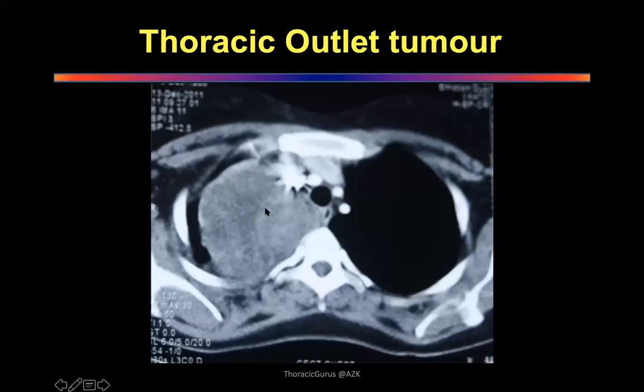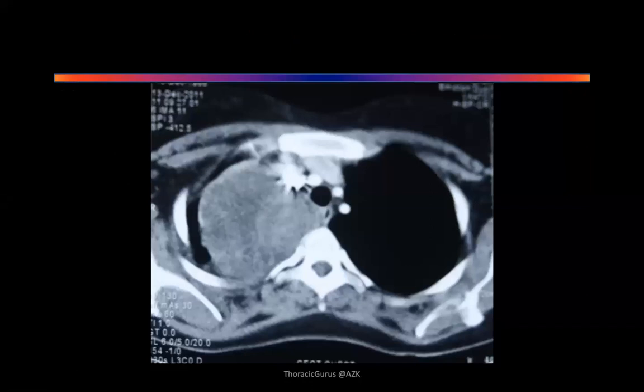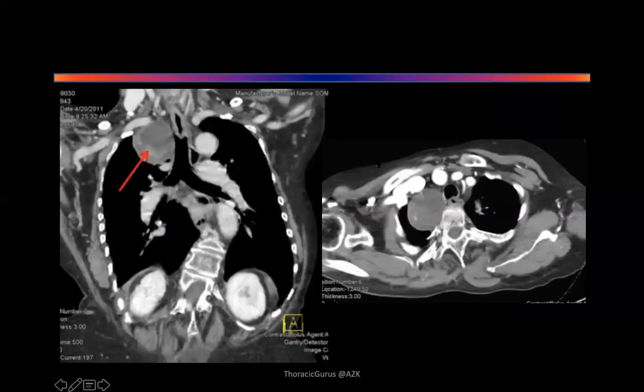Okay? Sir, in this particular thing, can we tell from which place it is coming? Posterior mediastinum? Very difficult to say that. Unless you see all the images, it's very difficult to say. But looks like it's in the posterior mediastinum. Looks like it's posterior mediastinal, but you have to see all the images. Okay, all right, come on. Next, quickly, Vikas, take it.